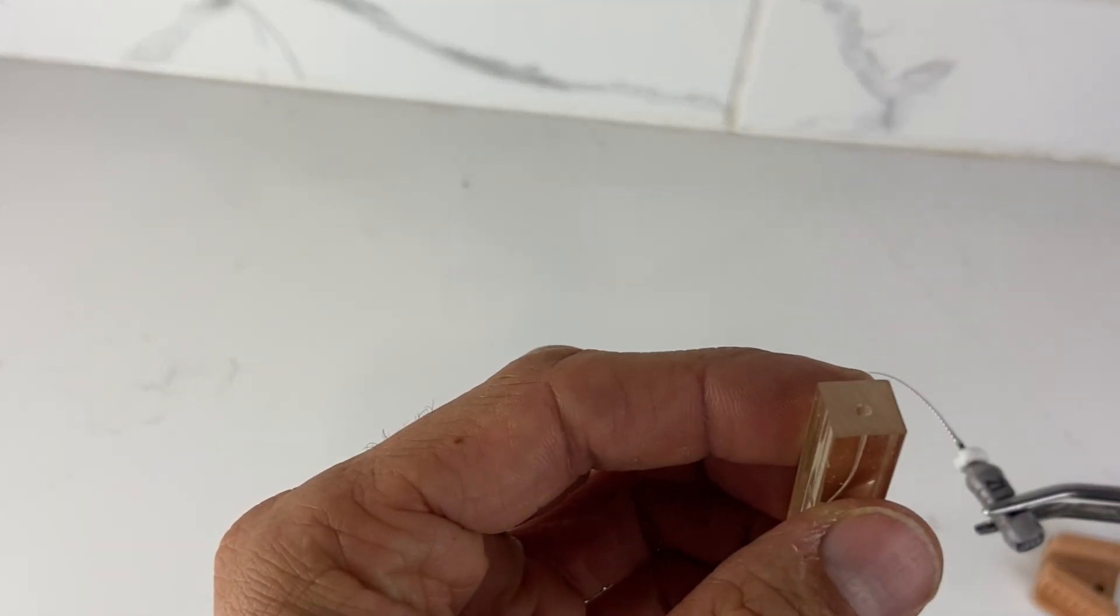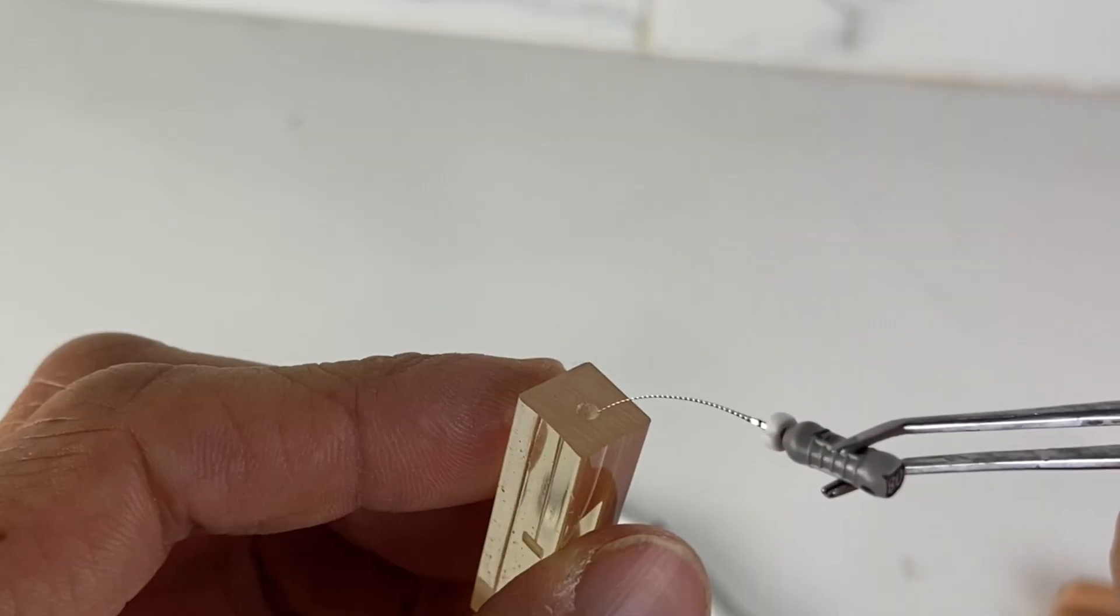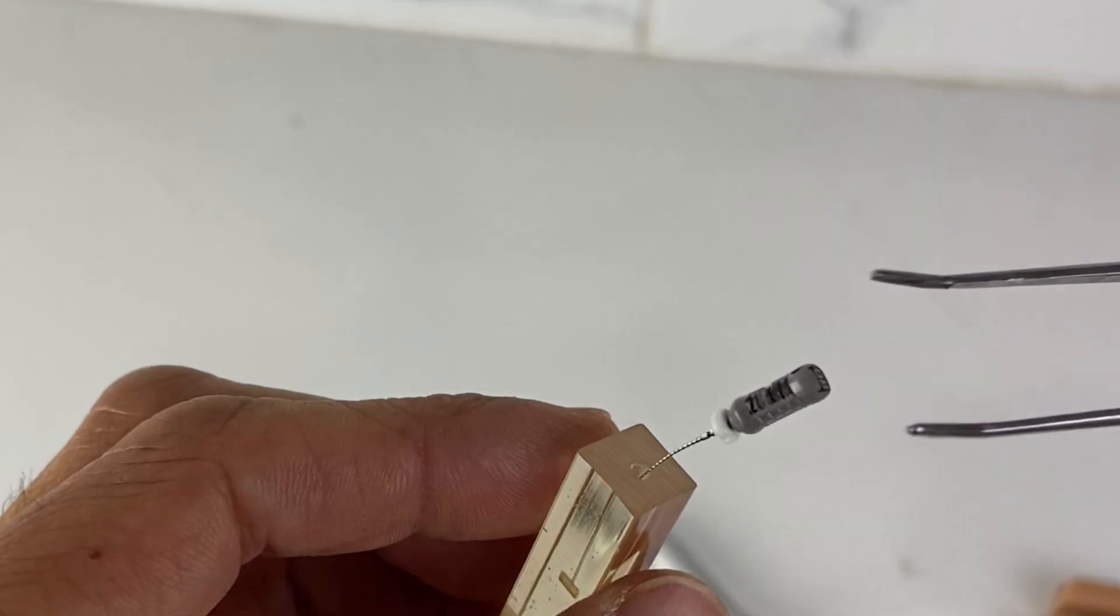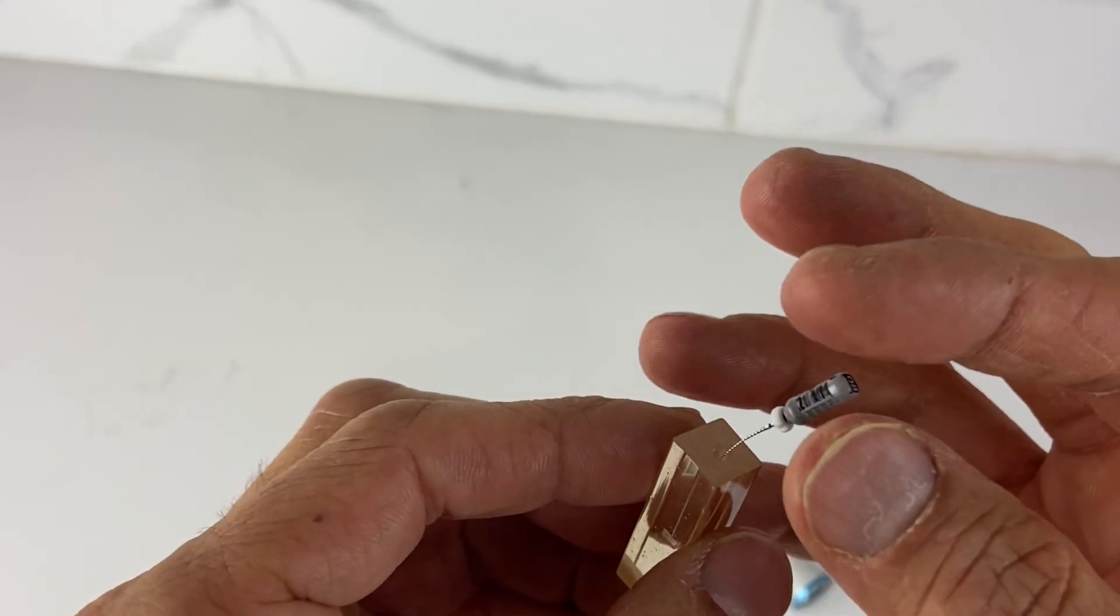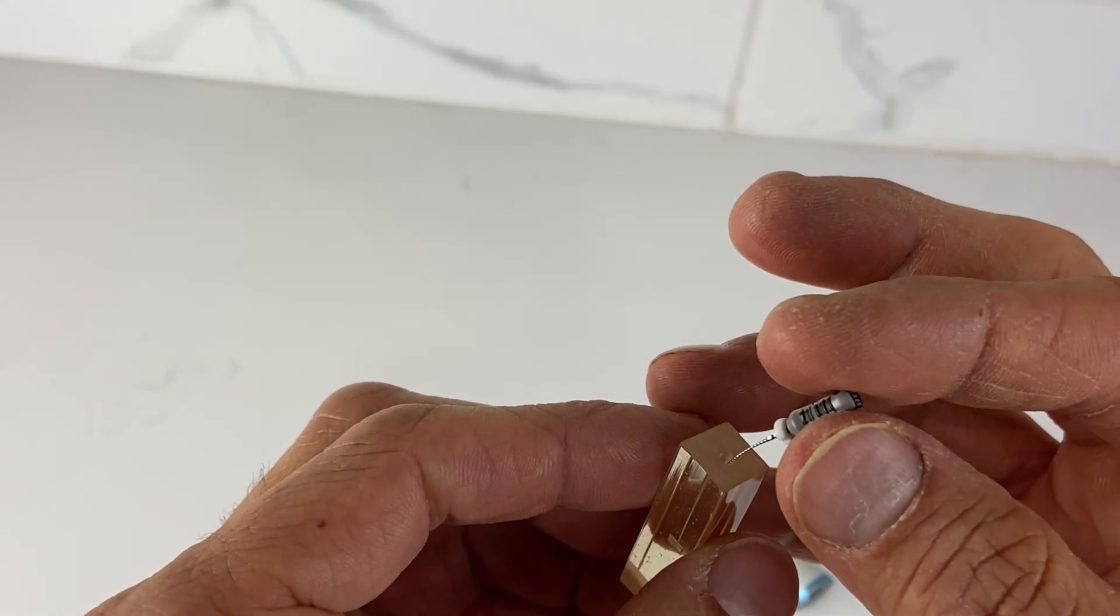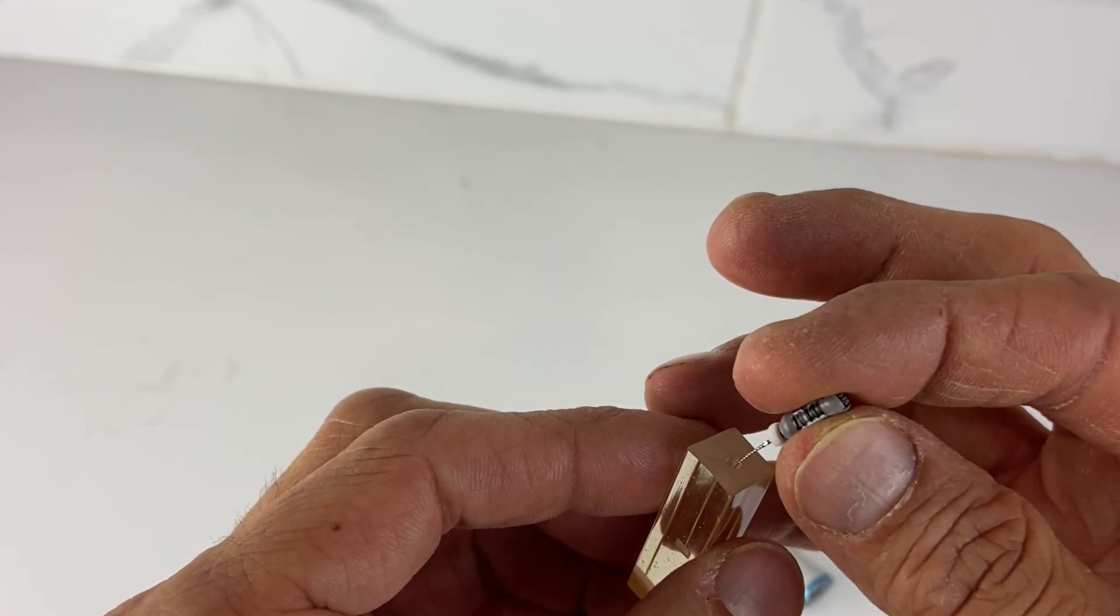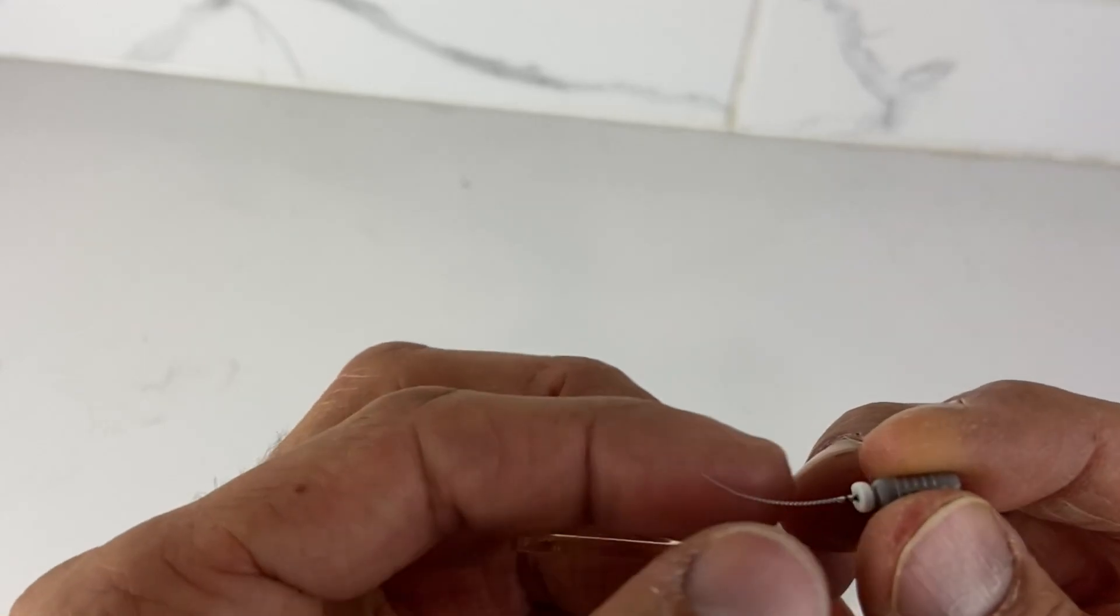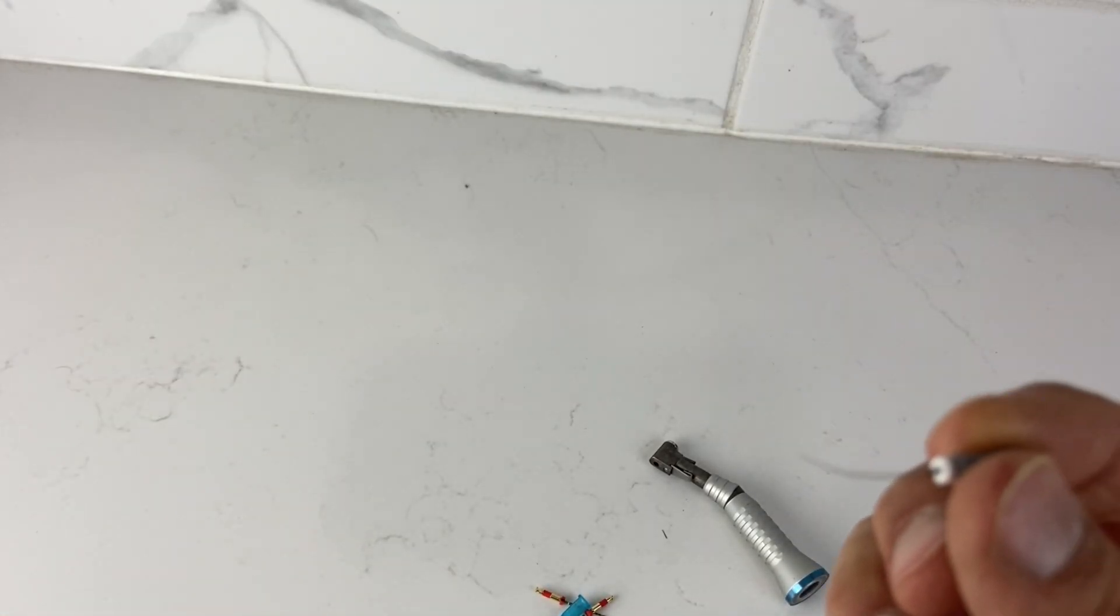What you're trying to do is sneak that in laterally with that banana curve and your forceps. So you're not getting your fingers in there. So it's going to kind of look something like this. It's going to sneak it in down. Down it goes and you'll kind of place it in there and it'll hold its place.